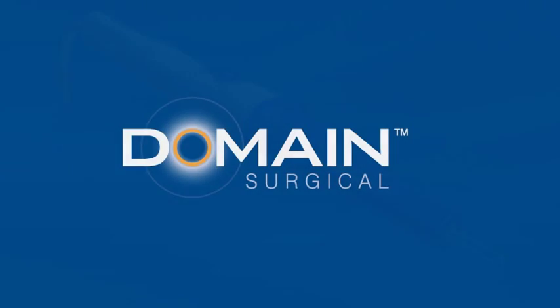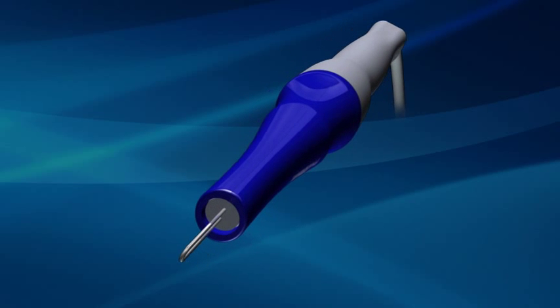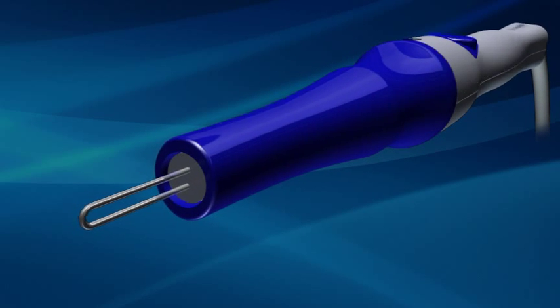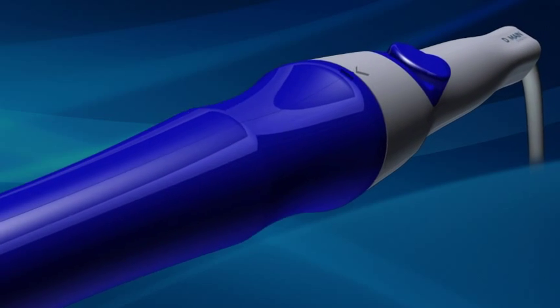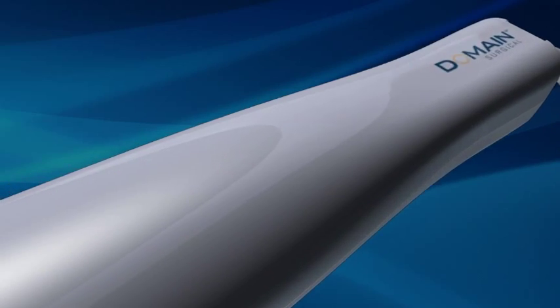The FM1 Ferromagnetic Surgical System harnesses the power of ferromagnetic heating. This innovative technology produces a remarkable hemostatic effect with minimal collateral tissue damage, while precisely incising tissue with tactile control.